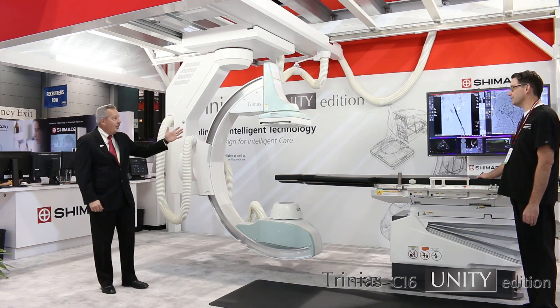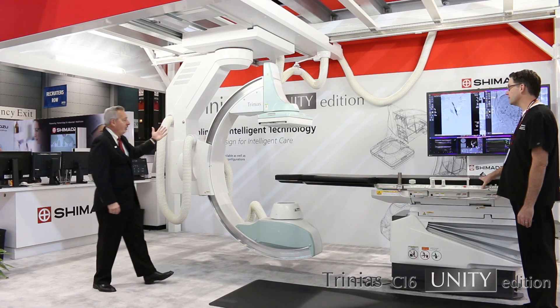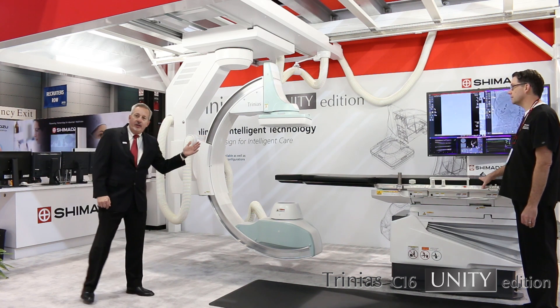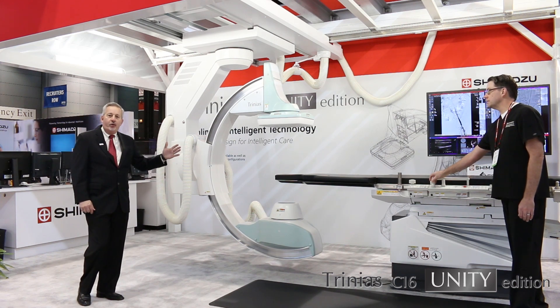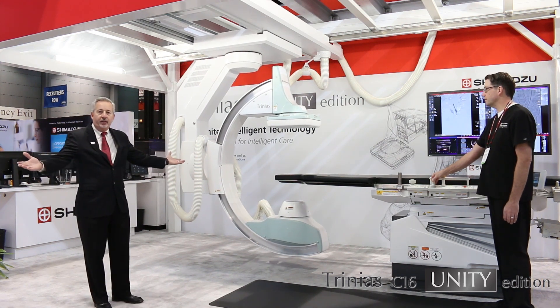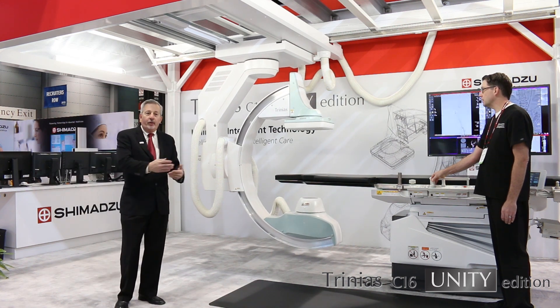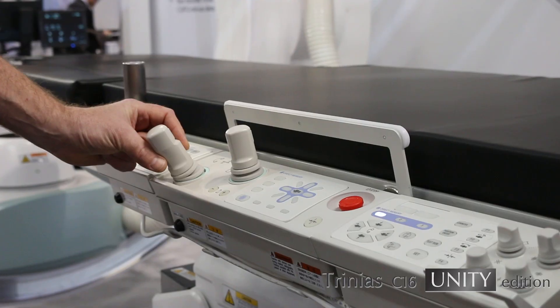The Unity C16 features the 12 by 16 detector, ceiling mounted as you see here. The unique feature of the C16 is the ability to move from side to side, going from fingertip to fingertip in access. In today's world, moving all the way around the patient — access all the way around the table and down the side — has become more important.